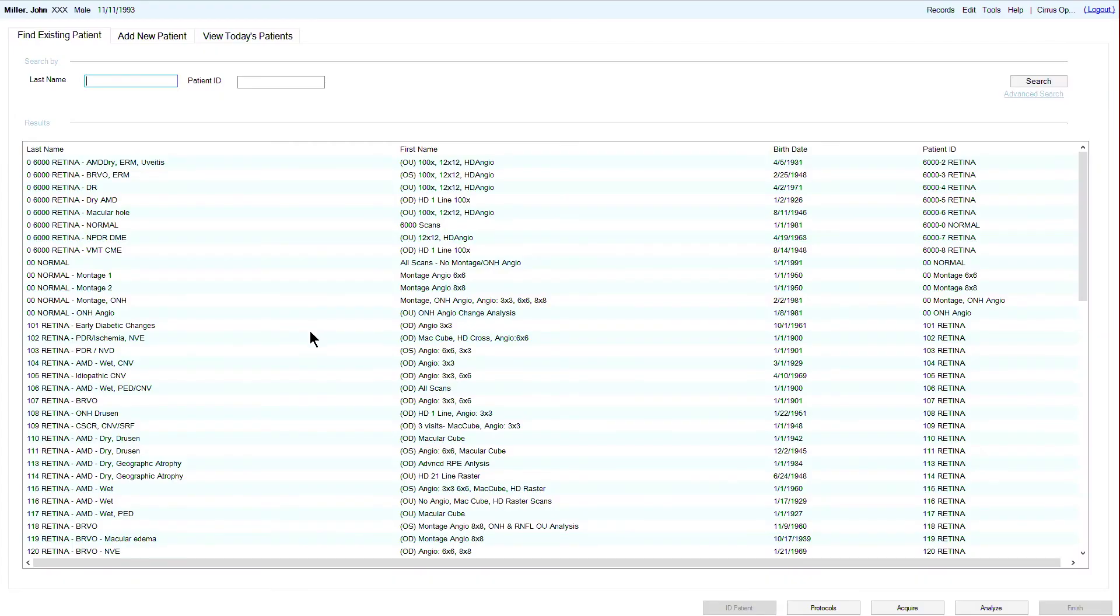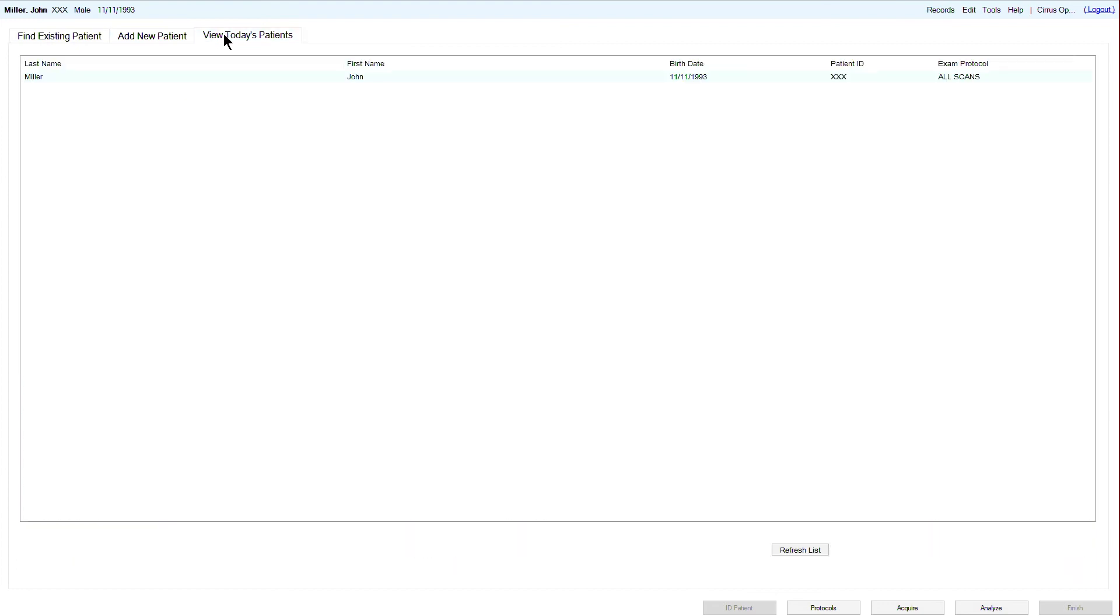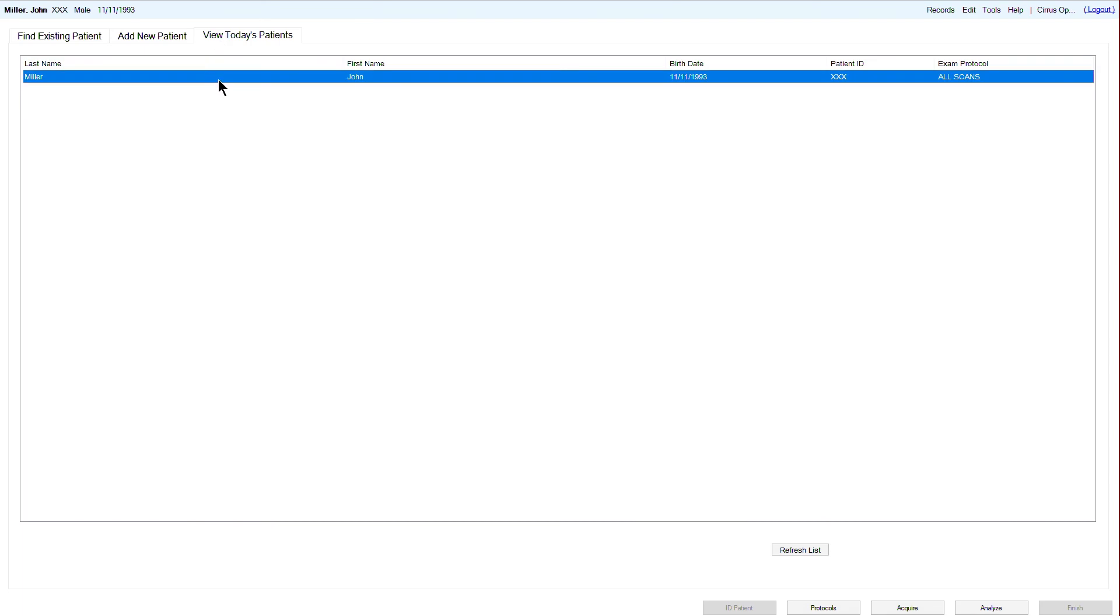Start by selecting an existing patient from the patient ID screen, add a new patient, or import a scheduled patient from the modality worklist if the CIRRUS is connected with FORUM. To acquire a scan for this patient, click Acquire.